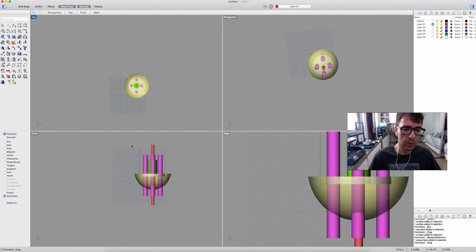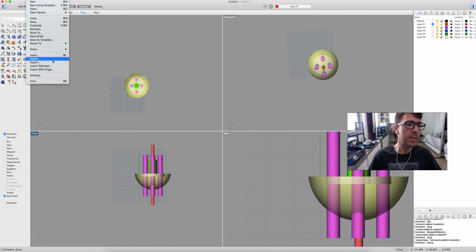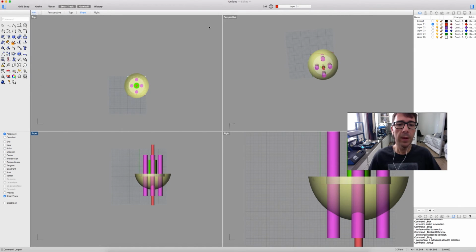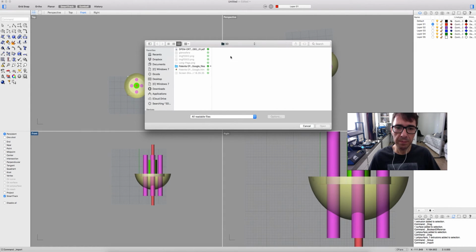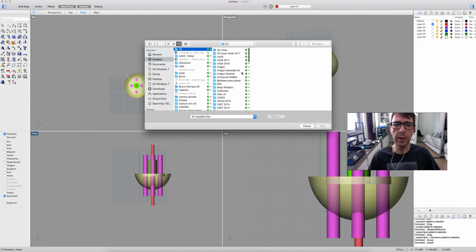I'm going to group all together, Ctrl G. Let's import a scapula. Let's choose a scapula from our files. I'm going to choose a scapula I'm working on right now. Just a second.